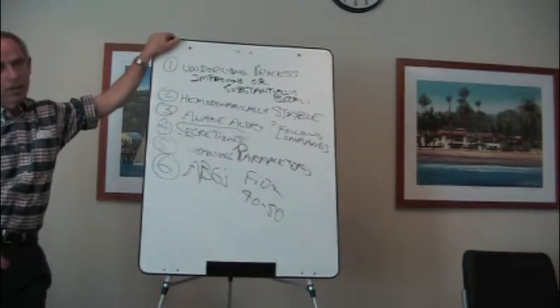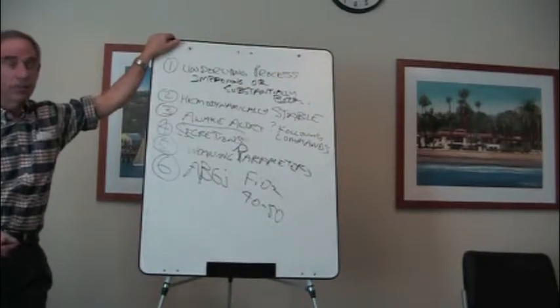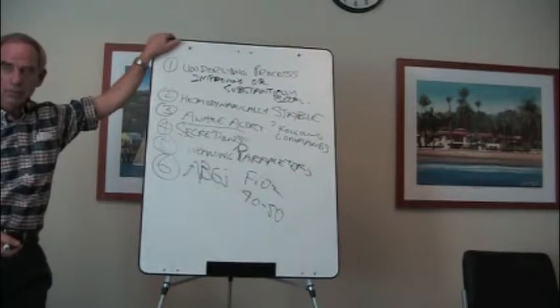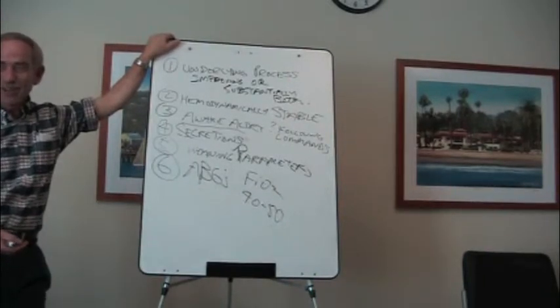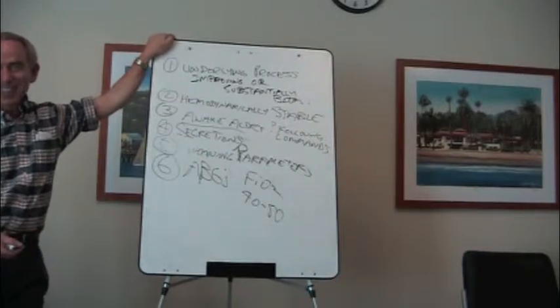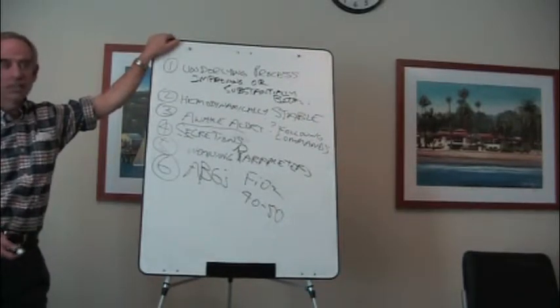Well, why not? I mean, we can give people supplemental oxygen above 50% when we extubate them, right? So why not just extubate somebody if they're on 70%? I think it goes back to the underlying process. So make sure the underlying process is better. Well, they were on 100, now they're on 70. That's better, isn't it? Still a ways to go. Not better enough. Not substantially better.